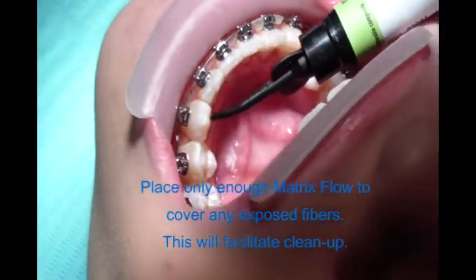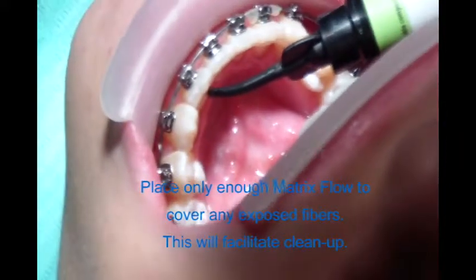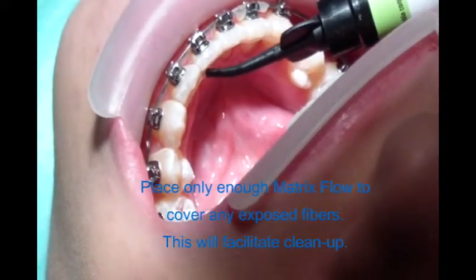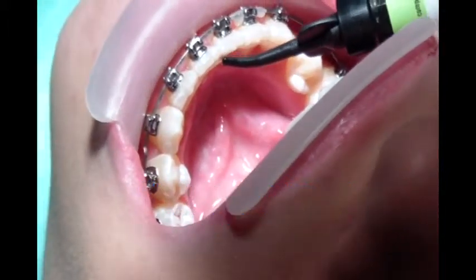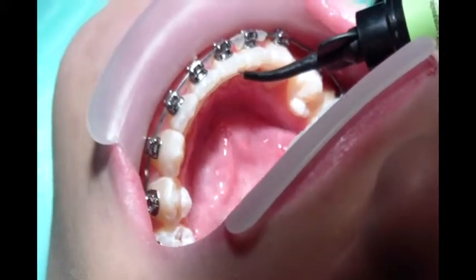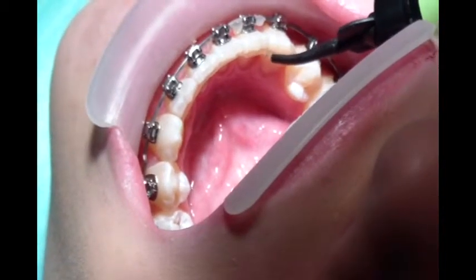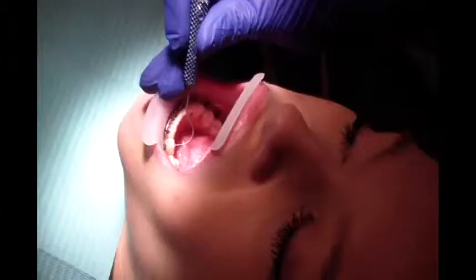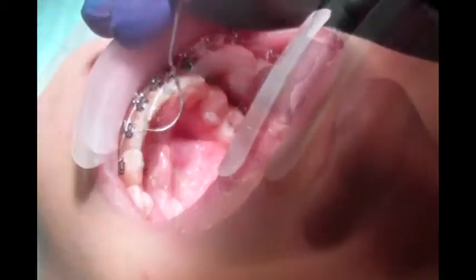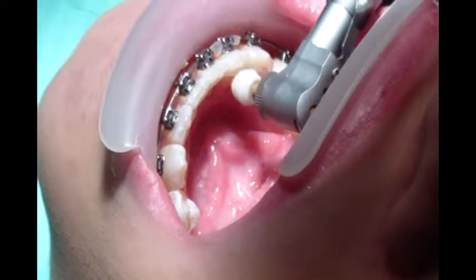Using the matrix flow syringe or brush, place a thin layer of matrix flow composite over the fiber retainer to seal the exposed surfaces. Light cure for 40 seconds. Once fit and occlusion have been verified and any excess composite is removed, polish the retainer to create a smooth surface for patient comfort.